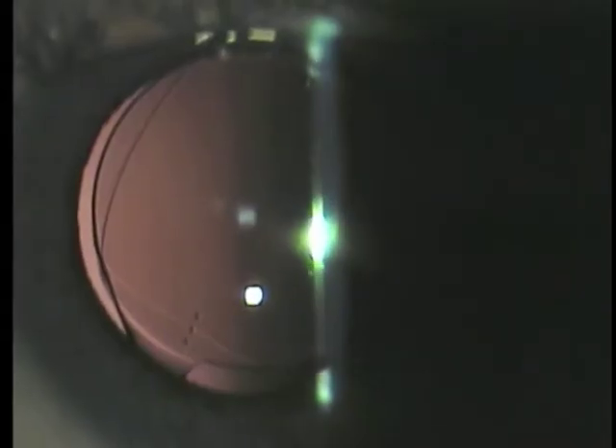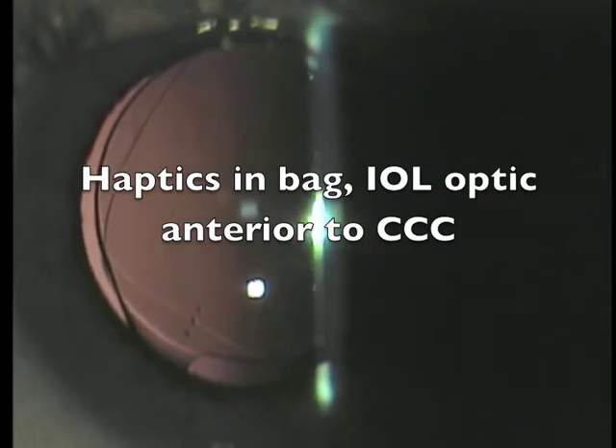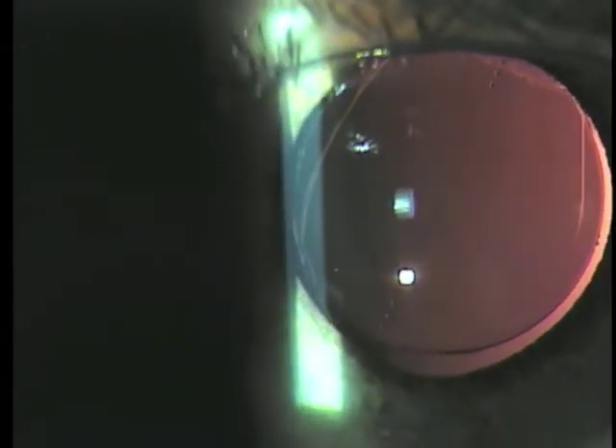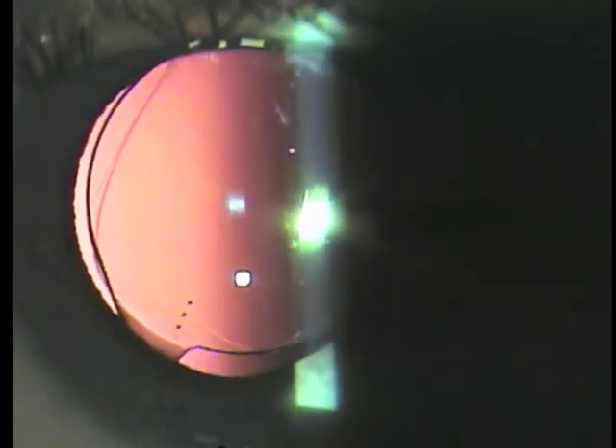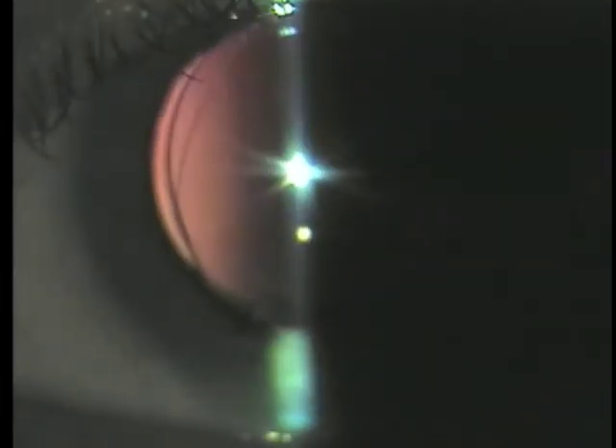I'd like to show the post-op slit lamp view of a technique I use of reverse optic capture by the anterior CCC to stabilize a rotating toric IOL when the bag is too big for the optic or for the lens. We don't like to put the haptics of one-piece lenses in the sulcus, but we can have the haptics in the bag and still use optic capture by pulling the optic out through the CCC to stabilize a toric IOL where the bag is too big for the length of the haptics and it rotates at time of surgery or post-operatively.